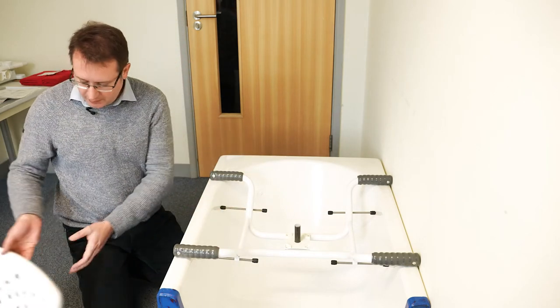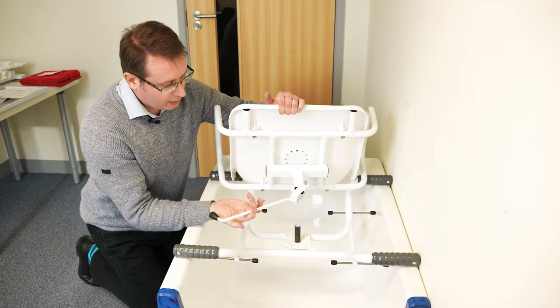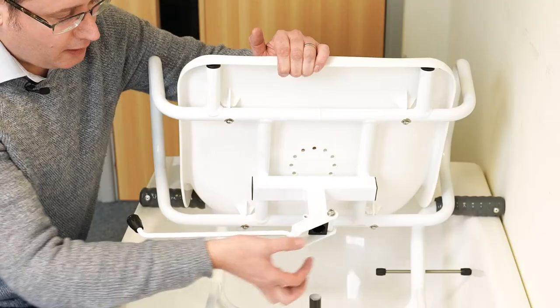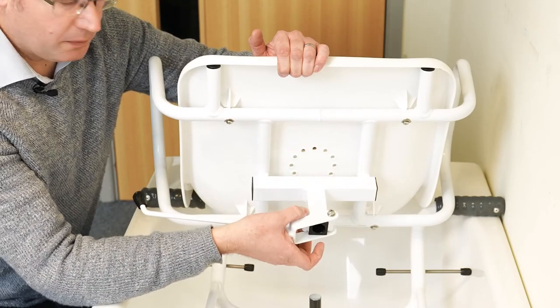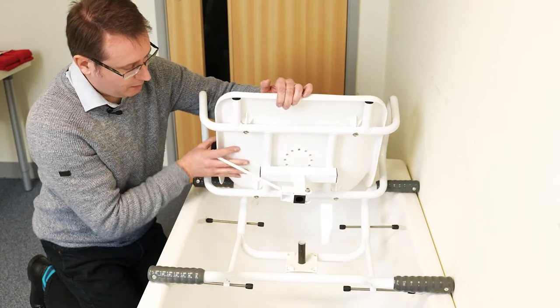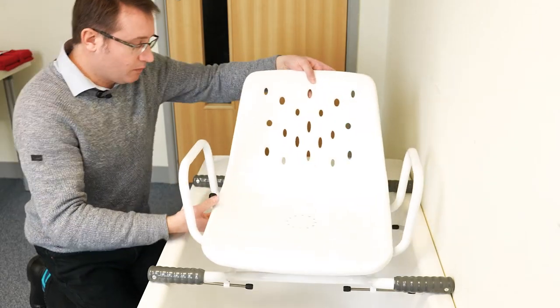If I now put the top frame in place, you'll see the locking lever is on the right-hand side as standard. You can change it to the left-hand side simply by removing the bolt, turning it around, and replacing the bolt. The socket in the bottom simply slots over the pin and pushes down.